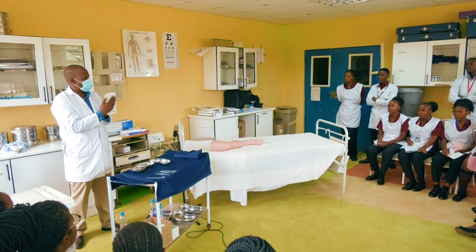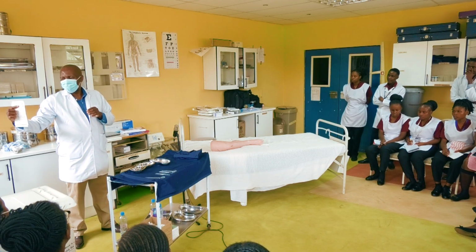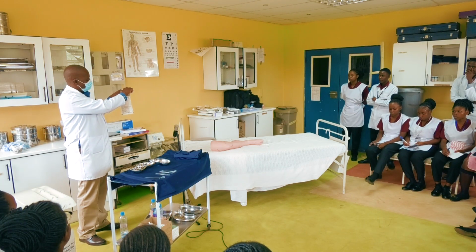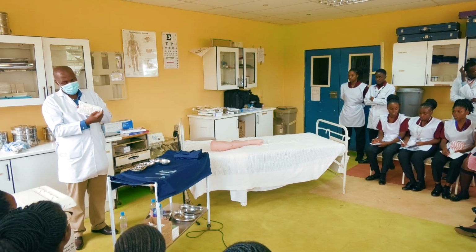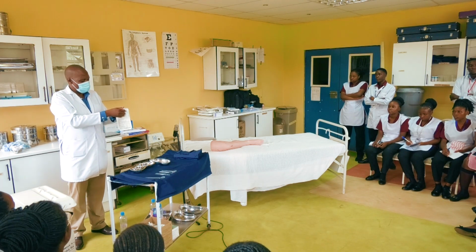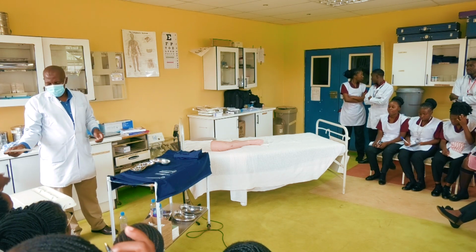There are always instructions on different types of gloves, right? So this one is saying, my assistant can read, tear down to open. There's even an arrow. So tearing, you go down like that, okay? Then I have to receive this from my assistant, so I'll allow my assistant to do that. Other gloves will have where you have to open. Just here you separate these two, then open them like that, then give to the one who is doing the procedure.